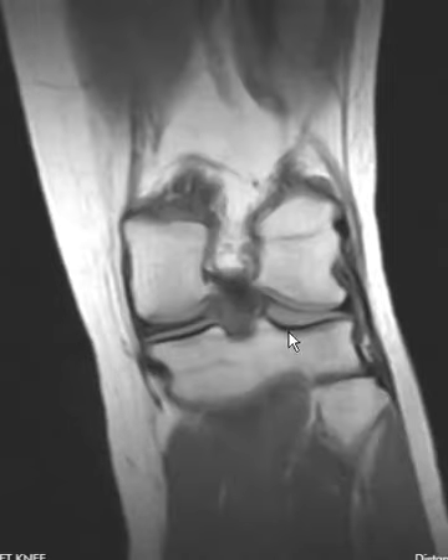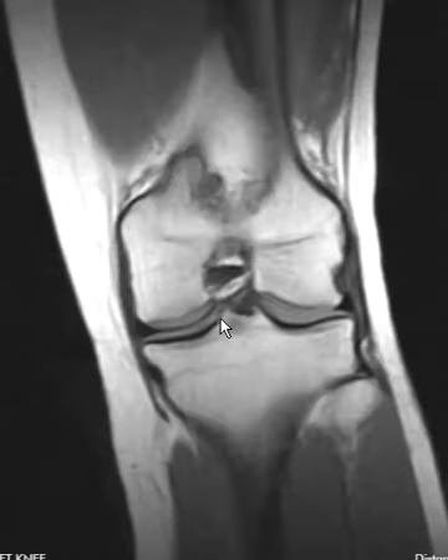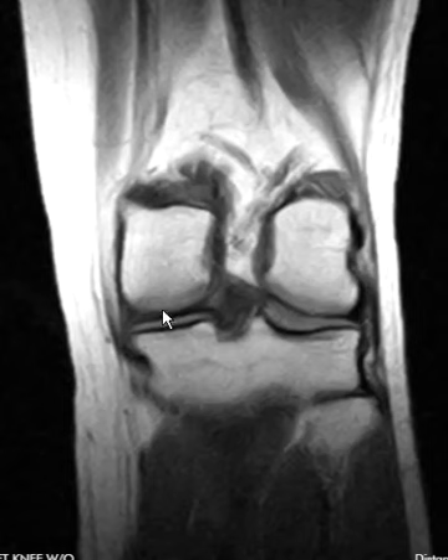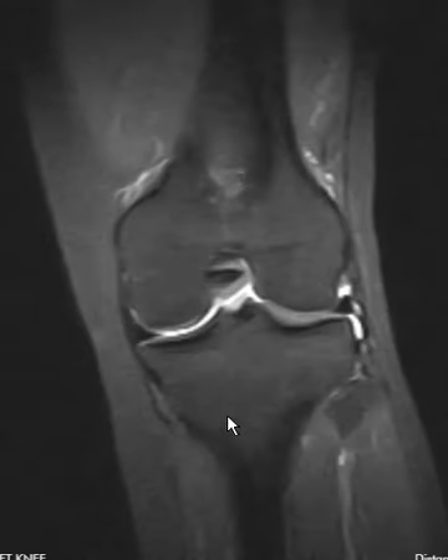If we go on to the back here, we do see that there is a little bit of fog back over here. It's hard to tell in this view but it catches the eye. That's the meniscus root where the posterior horn attaches back here, and if we look at the old study, that area looked more clean, a little bit better.